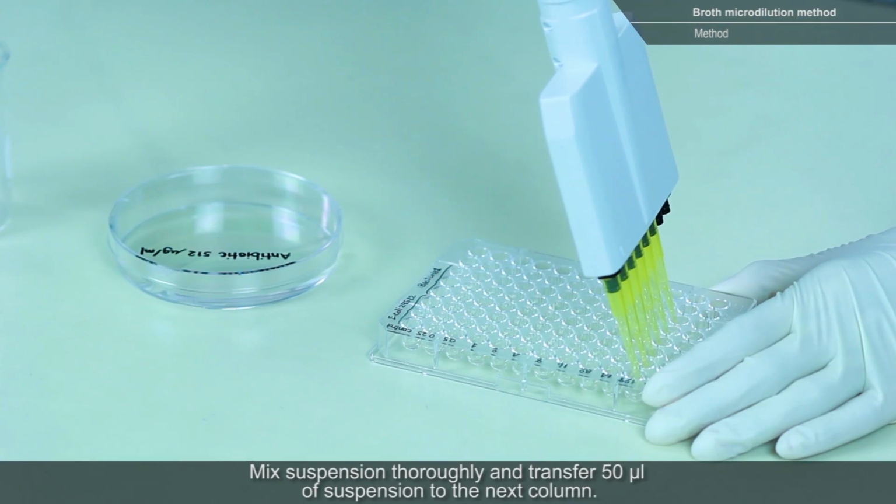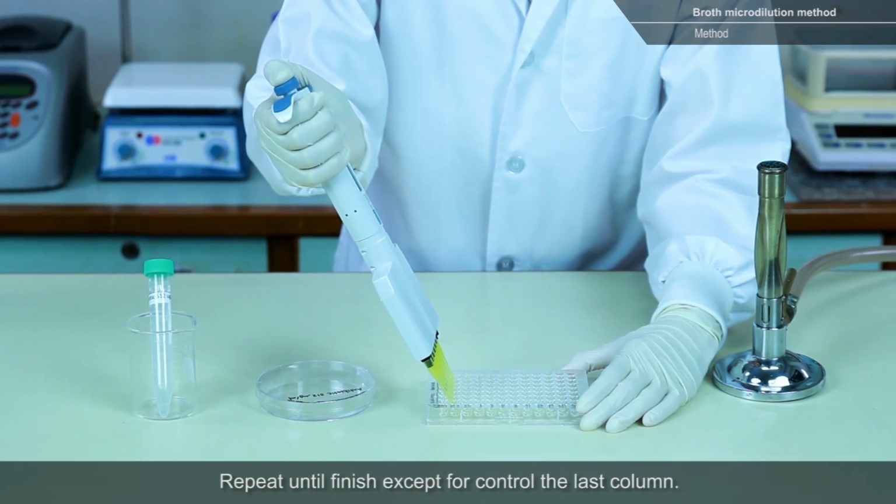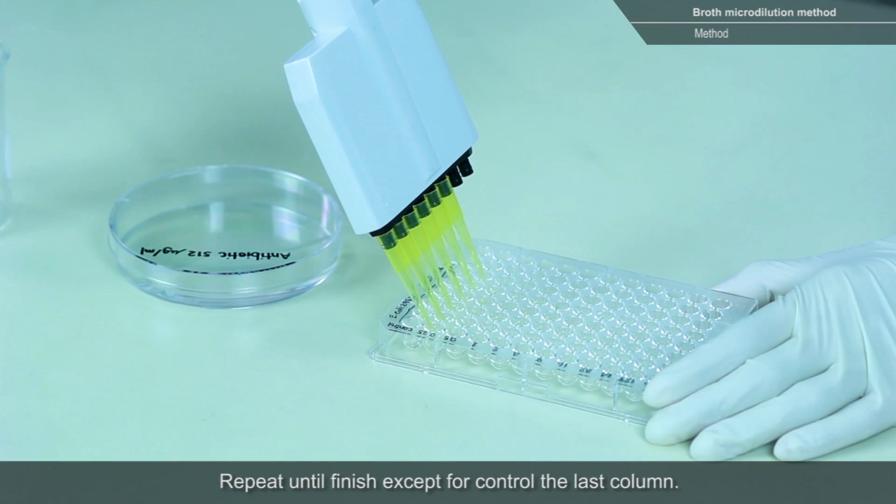Mix the suspension thoroughly and transfer 50 microliters of suspension to the next column. Repeat until finished, except for the control, the last column.